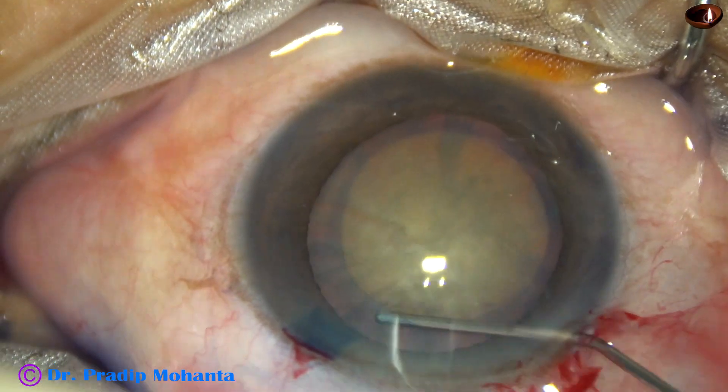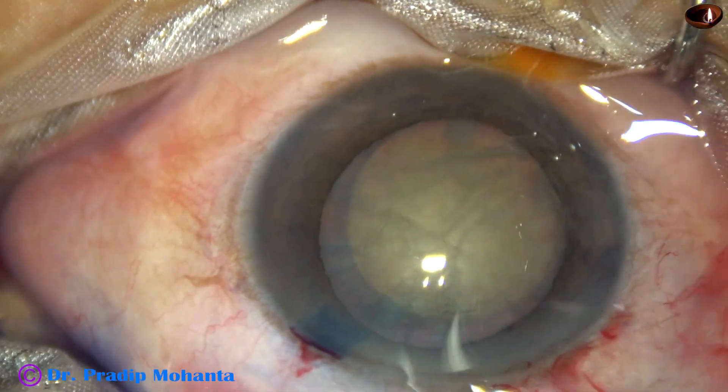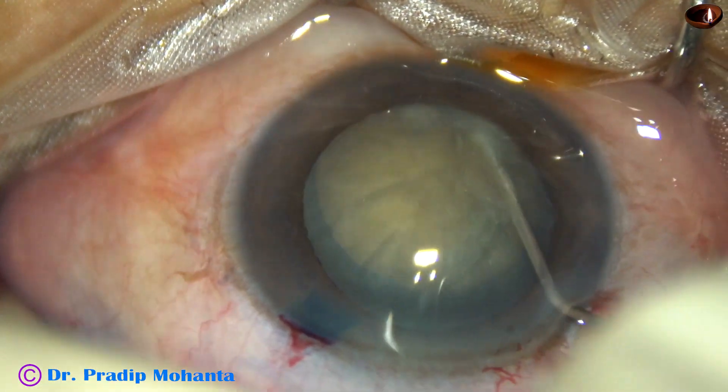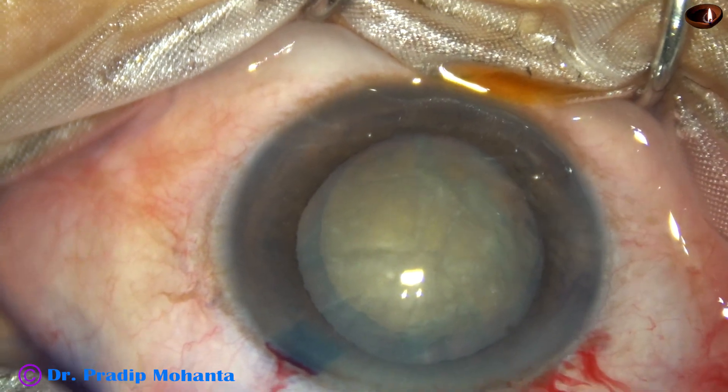Hydrodissection is to be done. A fluid wave is passed just under the anterior capsular rim, and then the nucleus is mobilized.